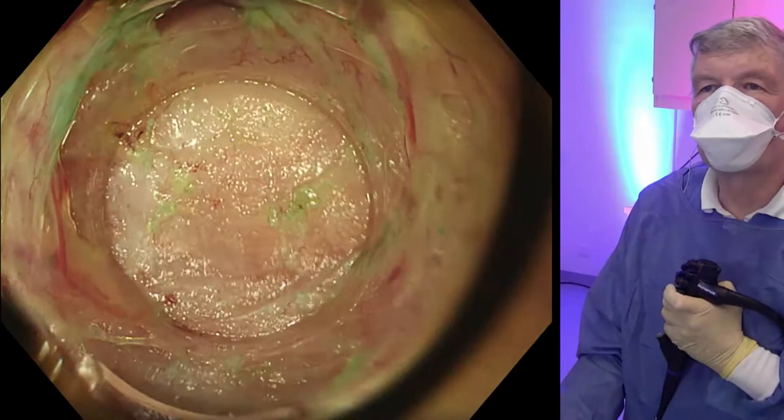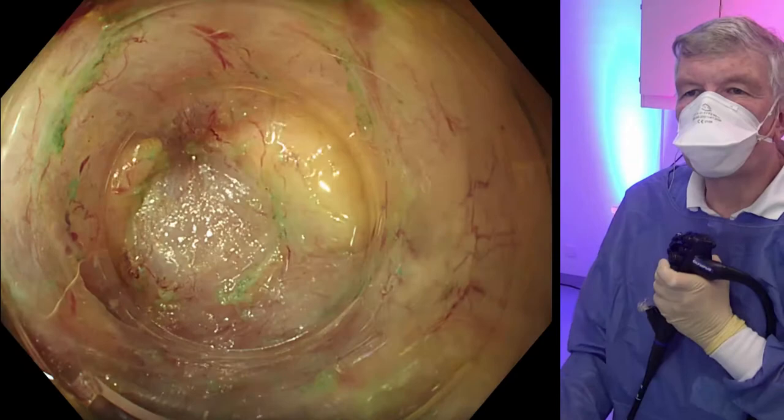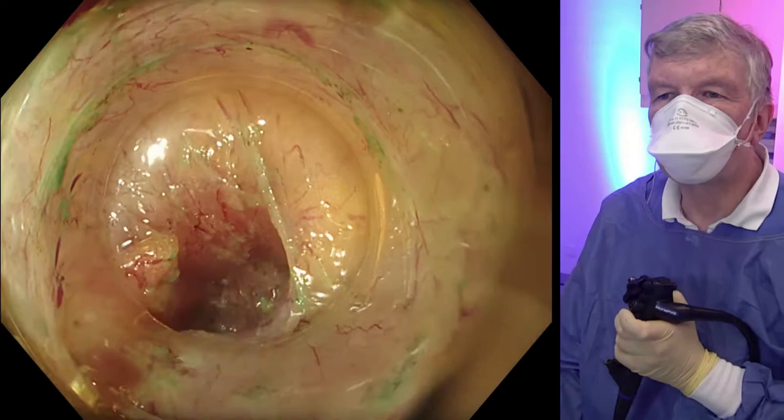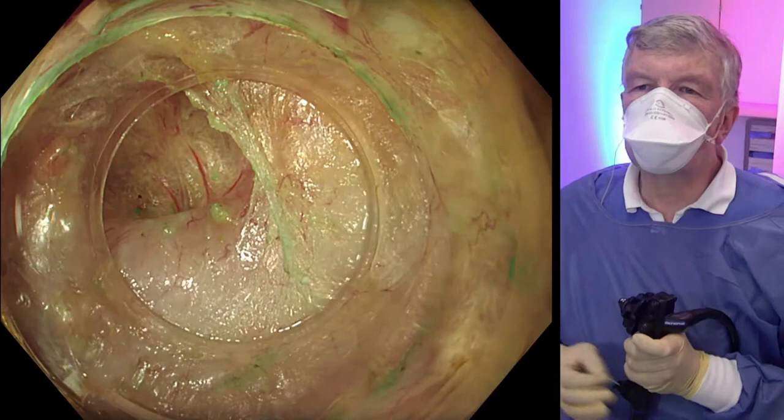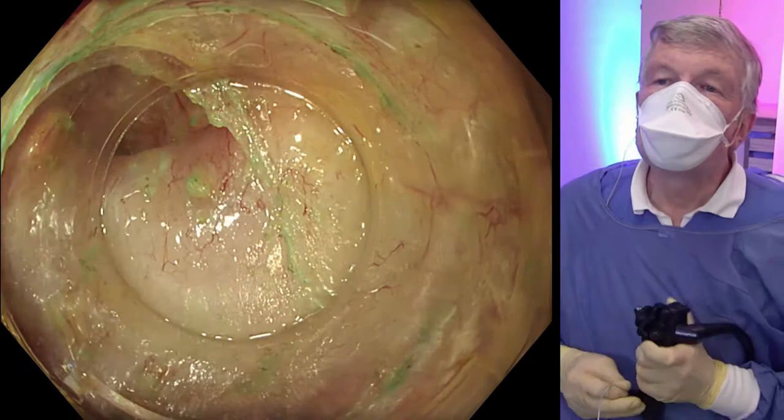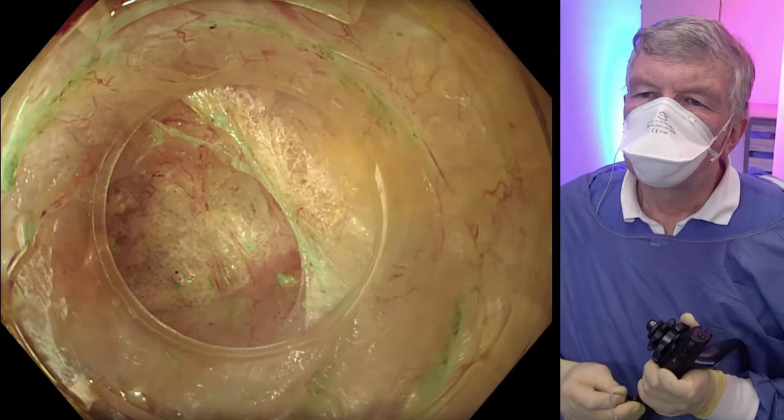Here is the full channel. Slowly upwards, and here is some motility happening, some submucosal fat. Then we proceed further, and we think this is already the pylorus, which is shown by the fact that there is a downwards direction after the pylorus of the submucosal tissue.